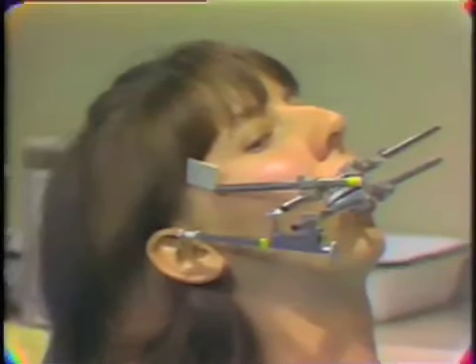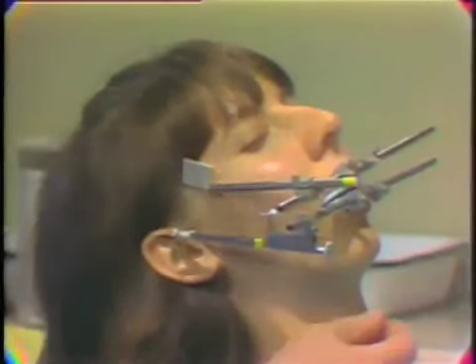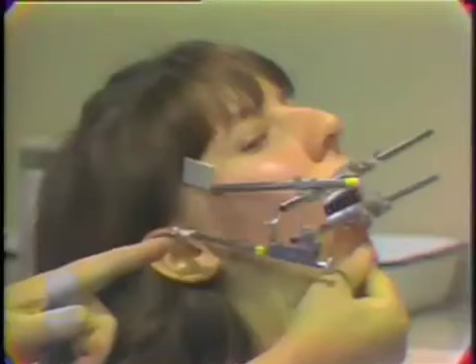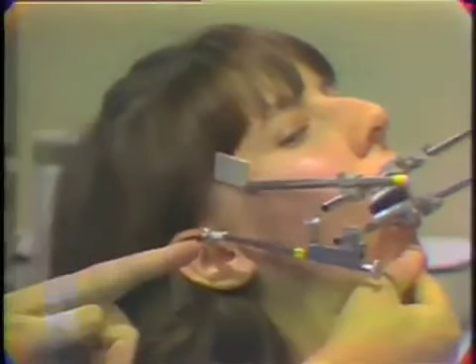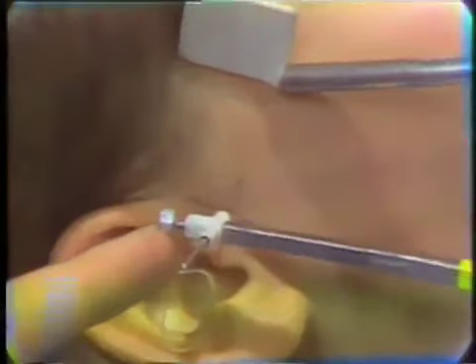The exact terminal hinge axis can be located kinematically by using the patient's opening and closing terminal hinge movements. As you see here, we have attached to the teeth, to move with the teeth, a stylus that has a contact in the vicinity of the condyle, so that as the patient opens and closes, we can see that the stylus rotates, or in this case, it arcs.